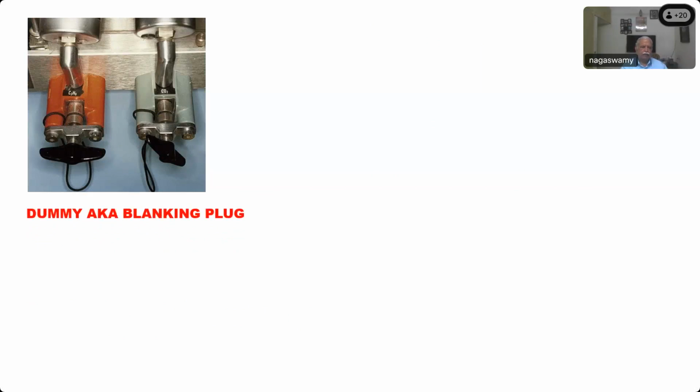Okay, this one. See, these are all the small things when the examiners ask you, and if you don't answer, they feel very elated. This very small thing we asked, even that if they are not able to answer, they feel very happy, sadistic. Okay, so this is called the dummy plug. Whenever there is no cylinder attached to the yoke assembly, it should always be kept covered to prevent any dust or oil particle going there, which can be the cause of combustion.